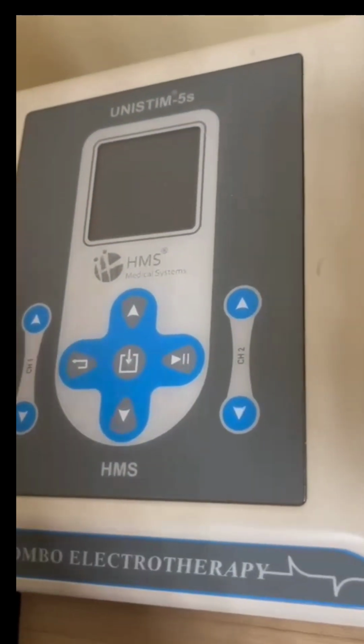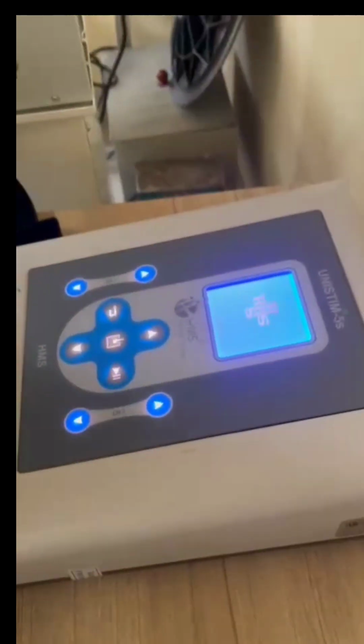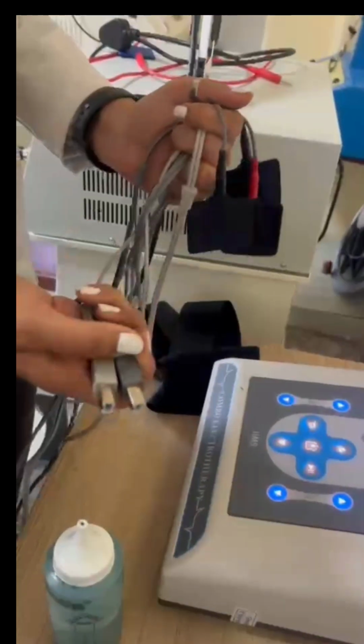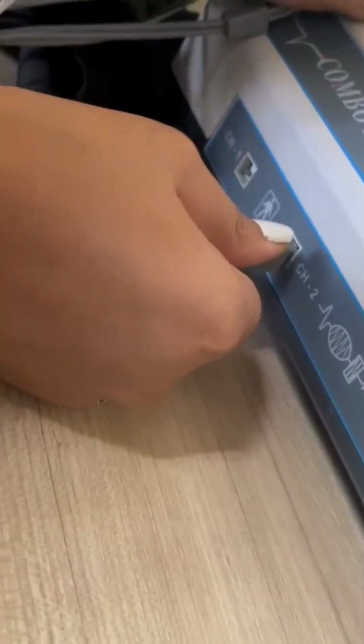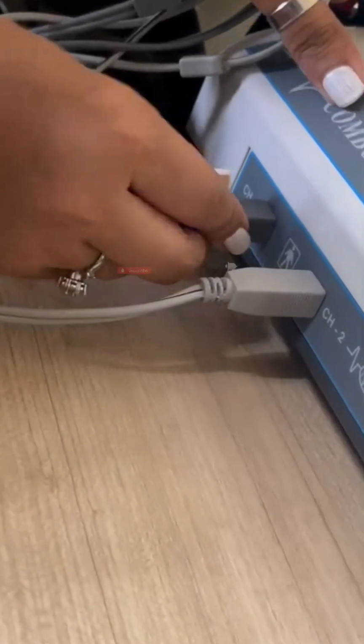Today we are going to discuss the TENS modality. Here we switch on the TENS modality. We have the electrodes, an end of electrodes and pads of electrodes, and we have two channels in the TENS modality. Here we can connect the electrodes in the TENS.